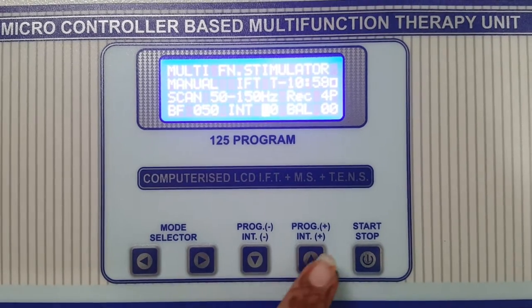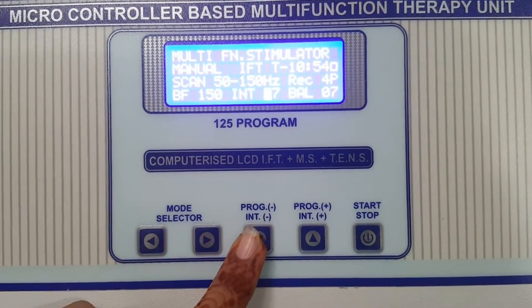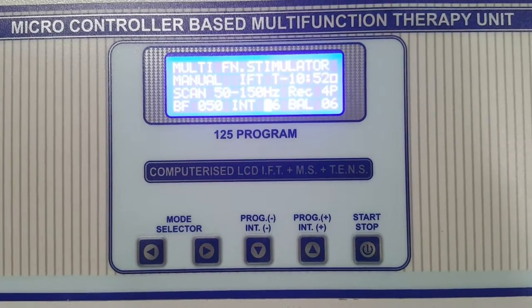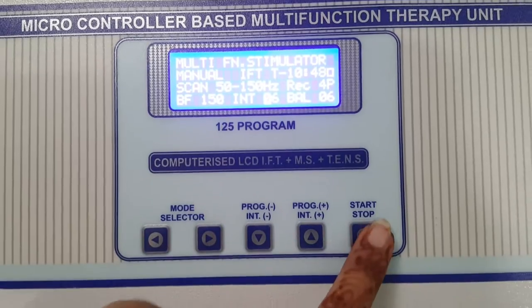Now increase the intensity as per your need — intensity up, intensity down. After treatment is completed, stop the machine.